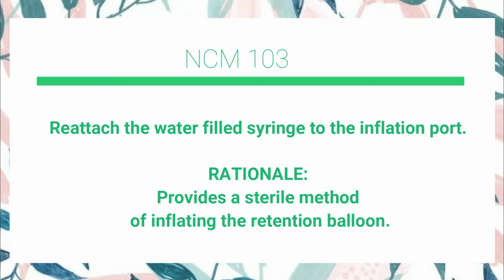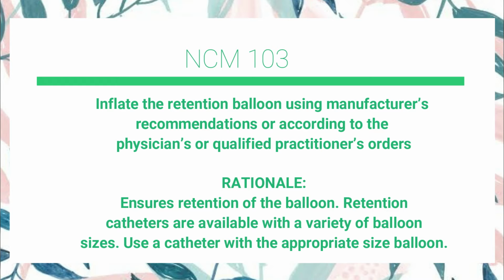Reattach the water-filled syringe to the inflation port. It provides a sterile method of inflating the retention balloon. Inflate the retention balloon using manufacturer's recommendations or according to the physician's or qualified practitioner's orders. It ensures retention of the balloon. Retention catheters are available with a variety of balloon sizes. Use a catheter with the appropriate size balloon.